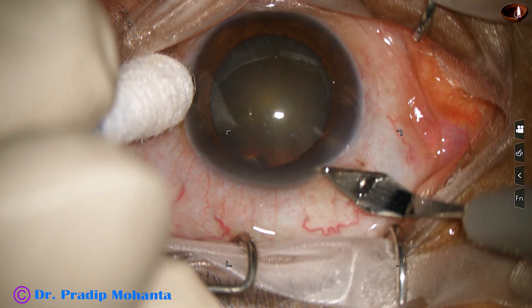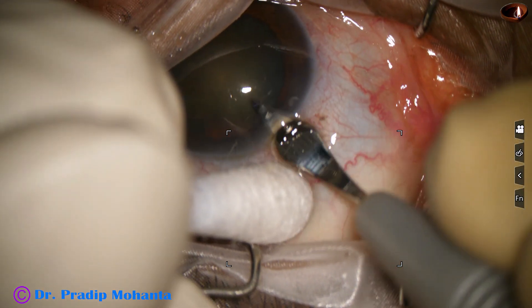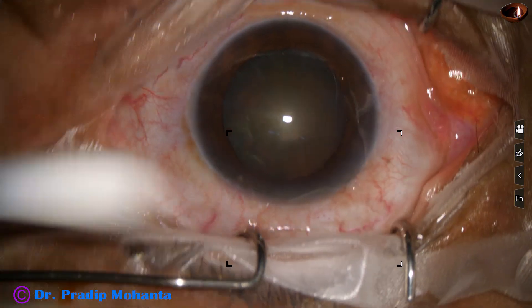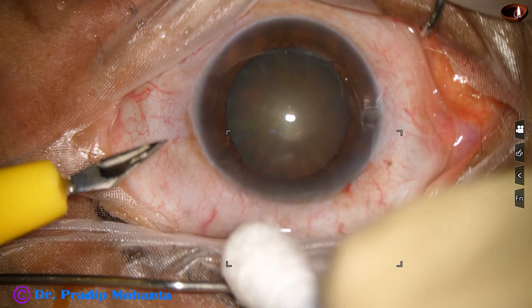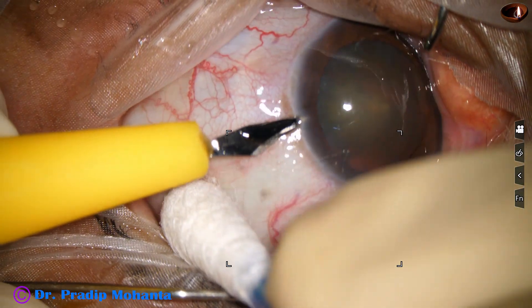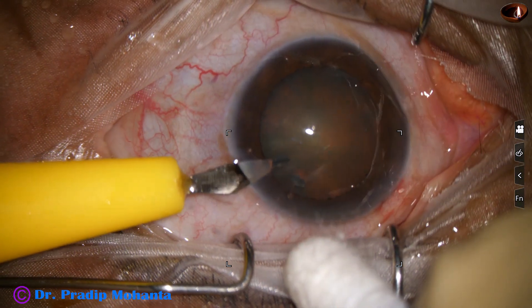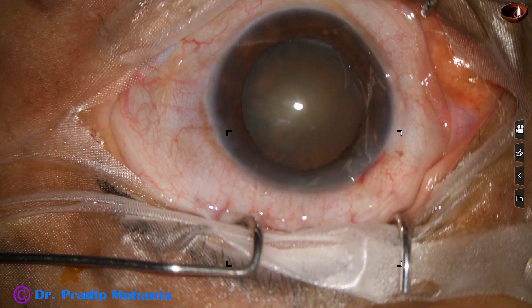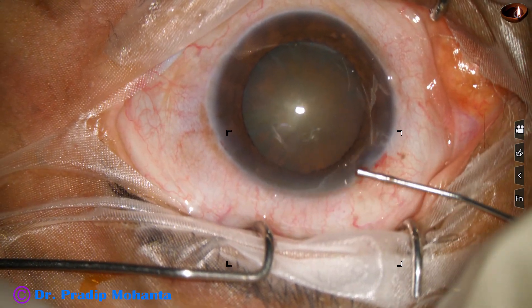This is a 2.8 millimeter steel keratome. The wound is created on the posterior aspect of the limbus. And then a side port is created about 3 clock hours away from the main incision on the left side. Only one side port has been made.